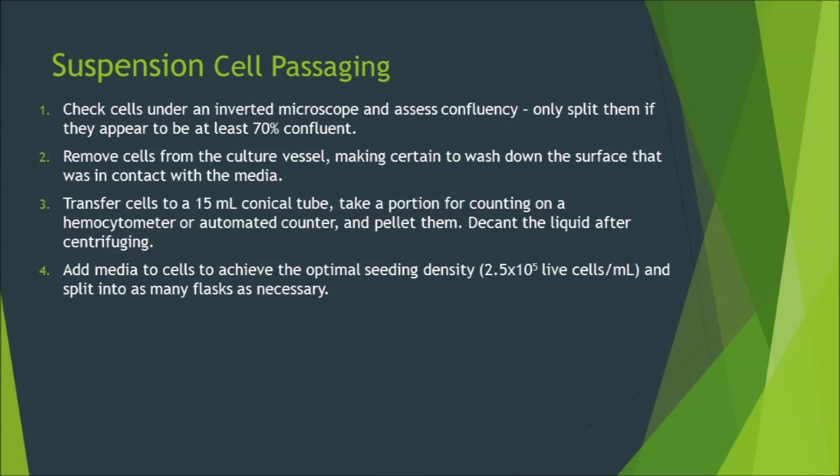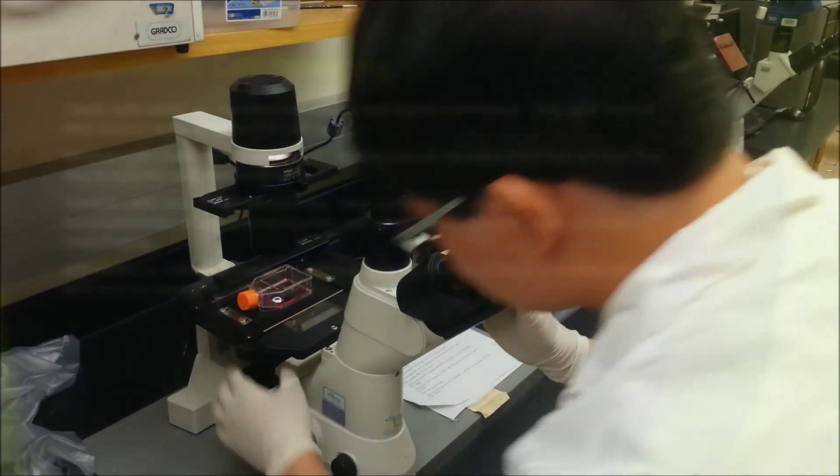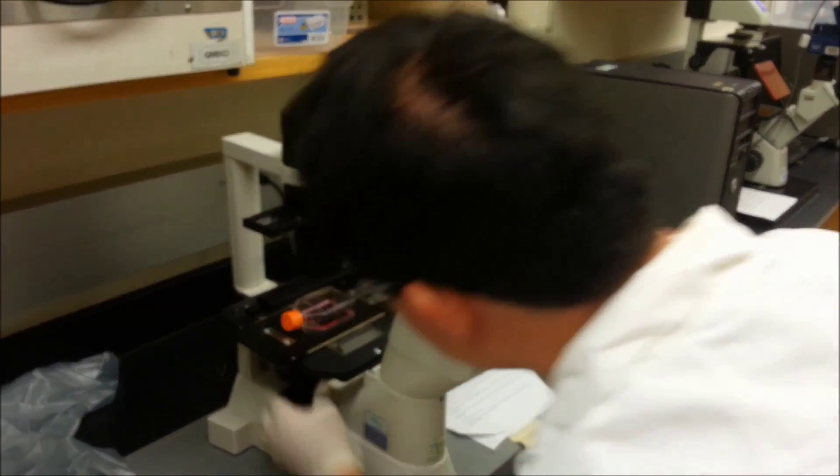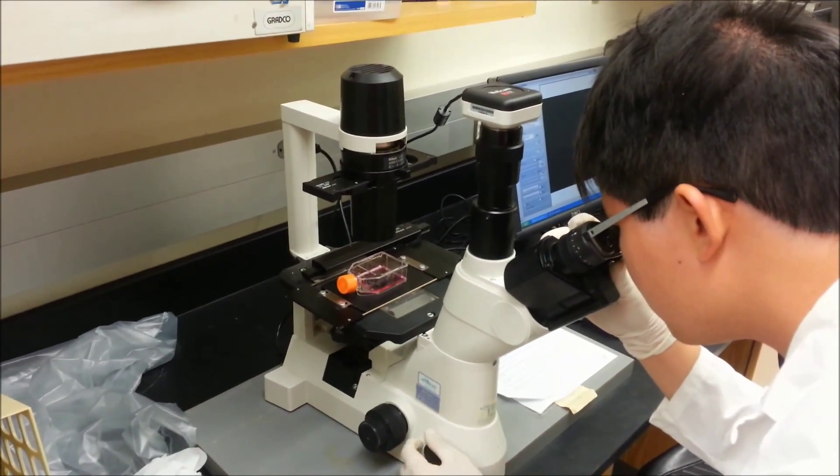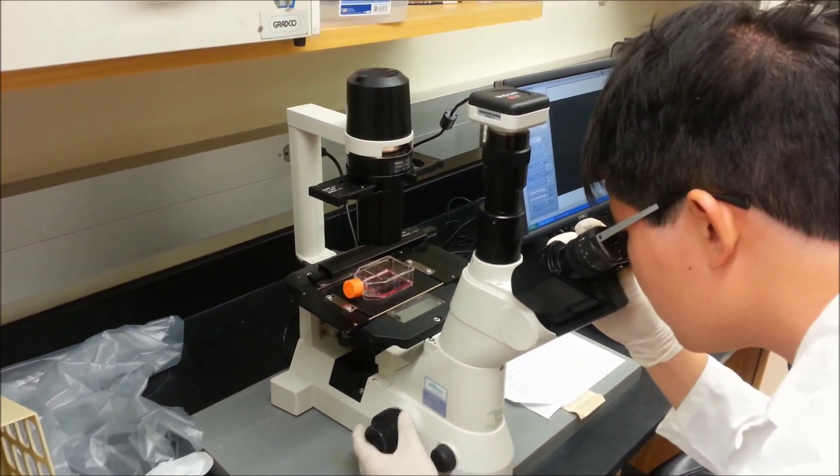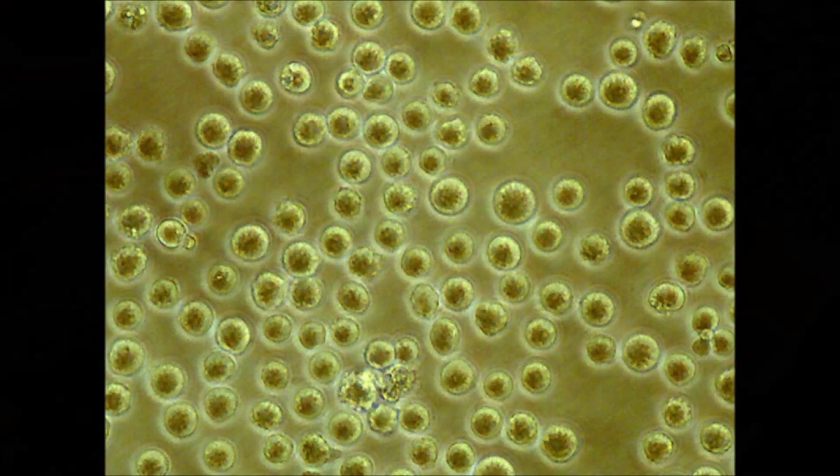Feel free to pause the video and take note of these step-by-step instructions for suspension cell passaging, but we will discuss these steps as we demonstrate the technique. Begin by checking the confluency of your cells under an inverted microscope. For suspension cells, they should look something like this when they are ready to be passaged.